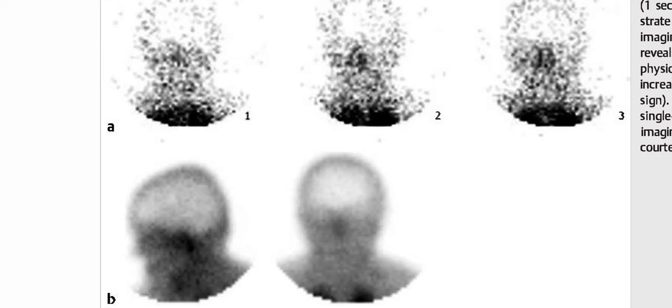in the nasal region, which is called the hot nose sign. So these findings were confirmed on the delayed single photon emission computed tomography imaging of the head, which is not included here. So the key finding here is of absent intracranial activity on technetium hexamethylpropylene amine oxime scan, that is HMPAO scan, and this is a diagnosed case of brain death. This hot nose sign is a very typical feature of brain death.